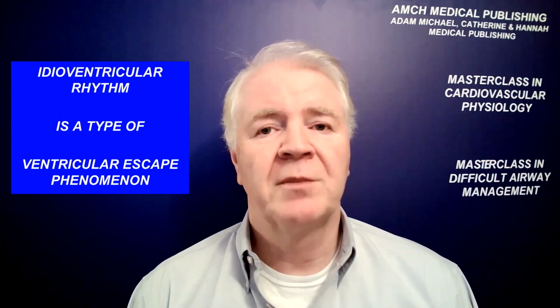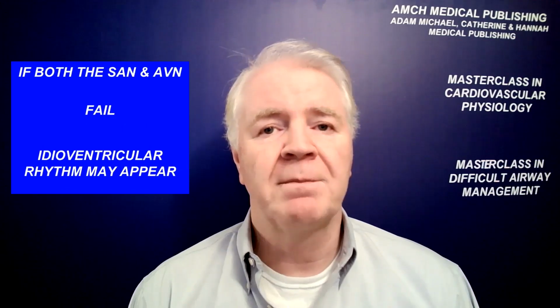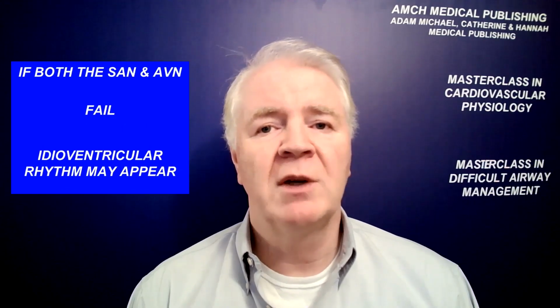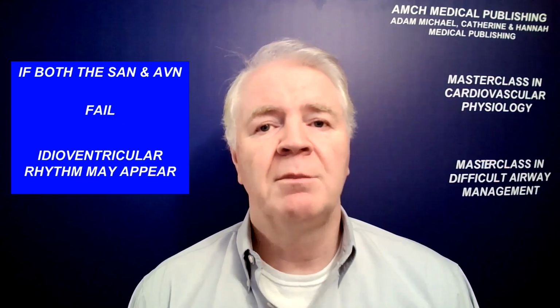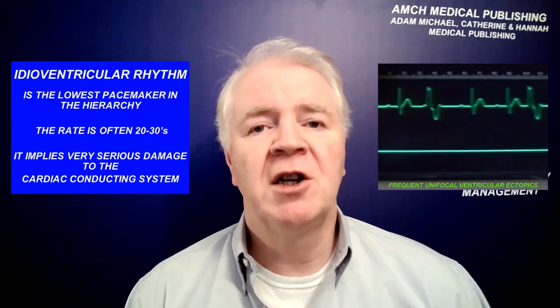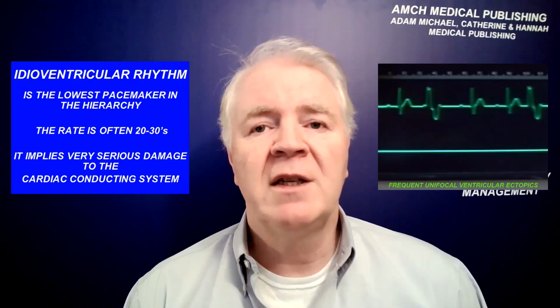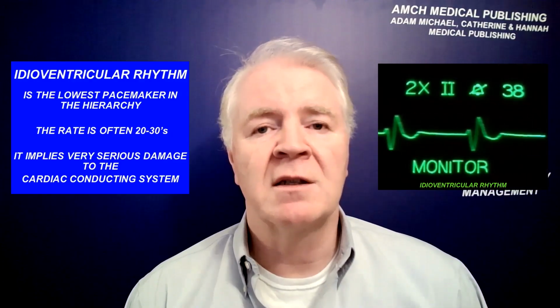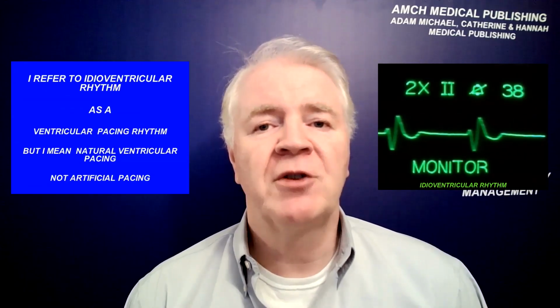Now let's move on. We will consider idioventricular rhythm. This is a ventricular escape rhythm. It usually occurs in the context of sinoatrial and AV node failure. If P waves are present but unrelated to the QRS complexes, then the diagnosis is not idioventricular rhythm but complete heart block. The ventricular Purkinje tissue pacing focus is the lowest in the pacing hierarchy. The heart rate is often in the 20s to 30s, and its presence indicates serious cardiac disease. The impulse may arise from Purkinje tissue or from damaged ventricular myocytes.